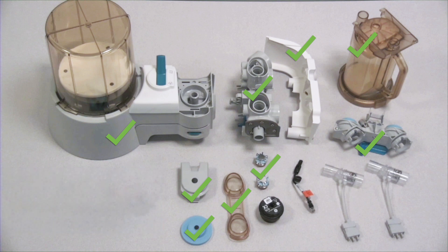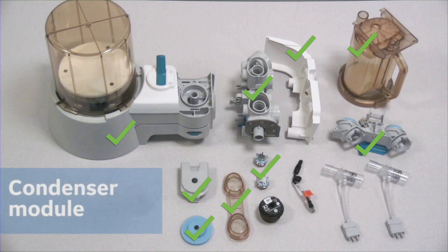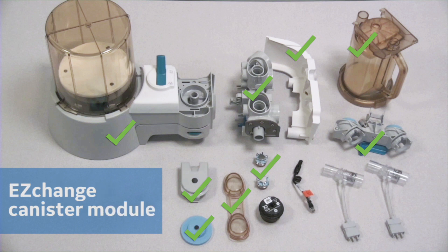The following items are not pictured but can also be autoclaved. If using a condenser, the condenser module as well as the condenser, and if using an easy-change canister, the easy-change canister module.